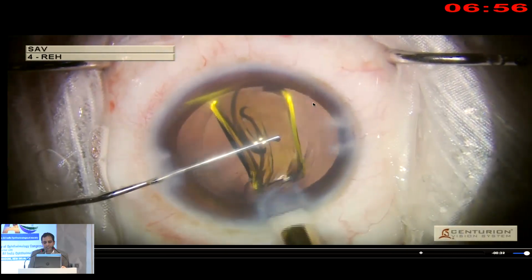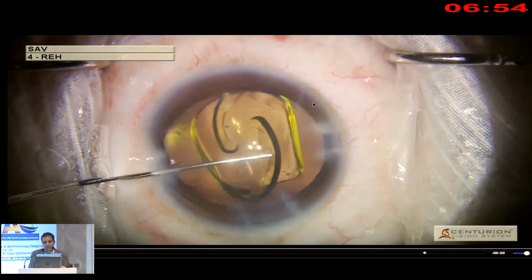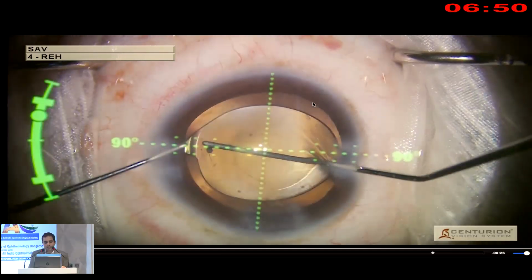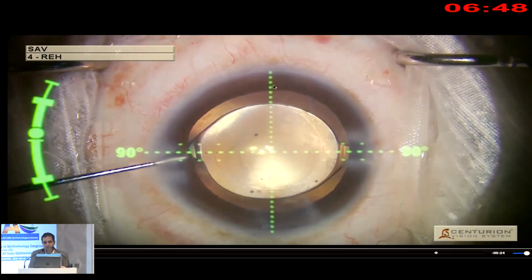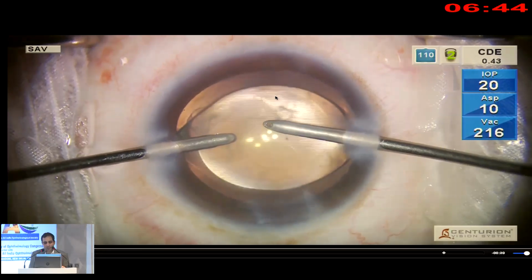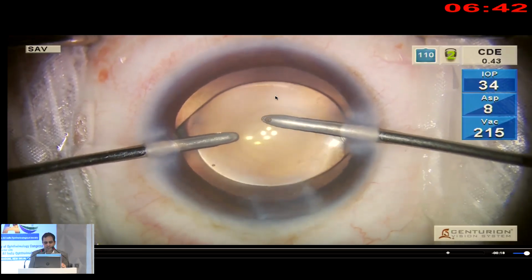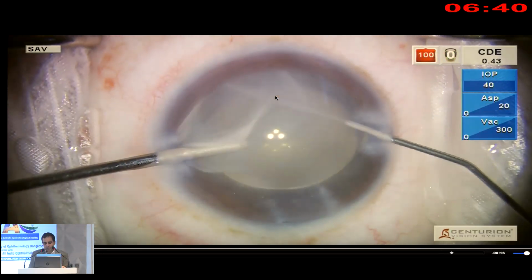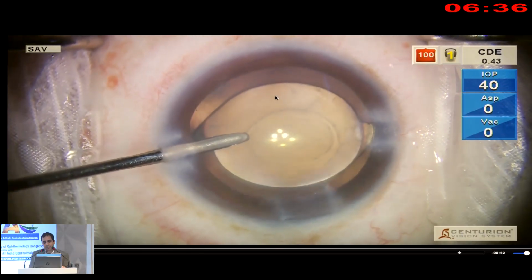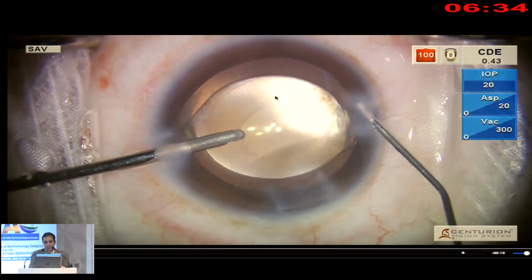We are going ahead and injecting this IOL under cohesive viscoelastic and making sure that it opens slowly and unfolds inside the bag, and then aligning it to its appropriate position. Now obviously you are not going to go behind the IOL to remove the viscoelastic in such cases, and therefore you can give mannitol to these patients post-operatively. Again, in the end, confirm that there is no further vitreous disturbance with your IOL manipulations.